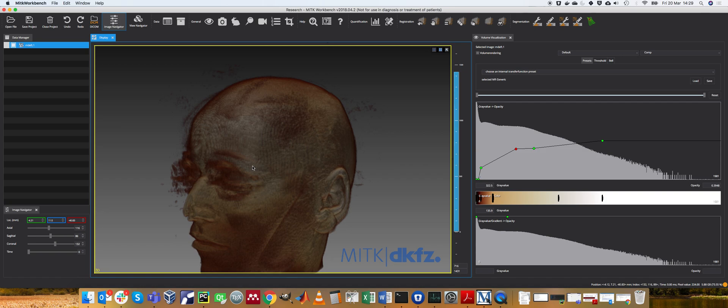So for example, bone in a CT scan is very bright. So that would be a really good candidate. You wouldn't have to segment anything, you could just look at the bone using volume rendering.